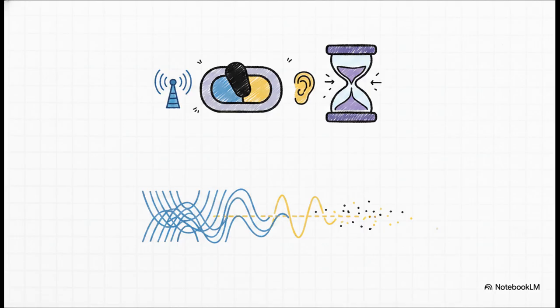You simply can't measure it instantly. Second, and honestly perhaps more importantly, the FID signal is highly susceptible to external magnetic inhomogeneities. Basically, the magnetic field of an MRI scanner is never perfectly uniform, and this lack of uniformity causes the FID signal to dephase and just disappear way too quickly, totally ruining the image quality. The real world is, well, it's just a bit too messy for this sequence.